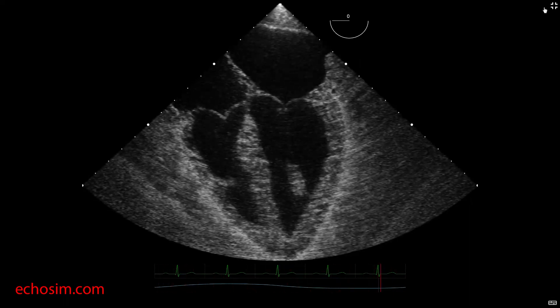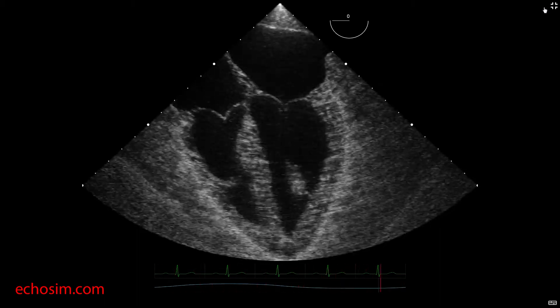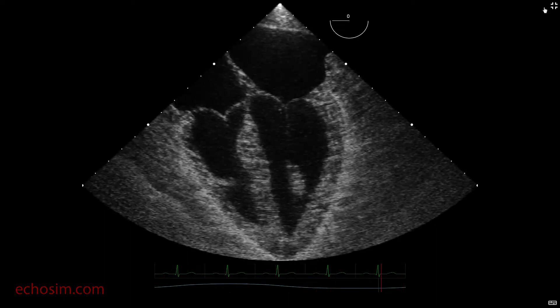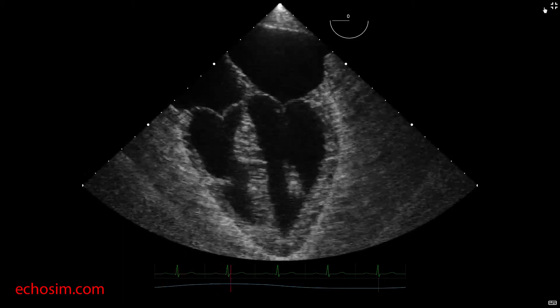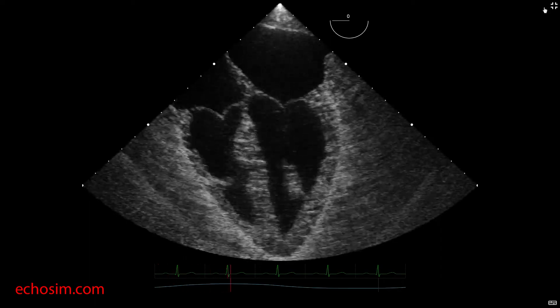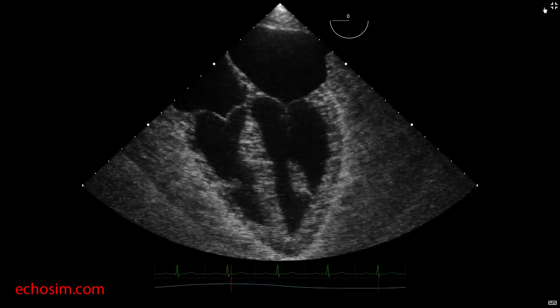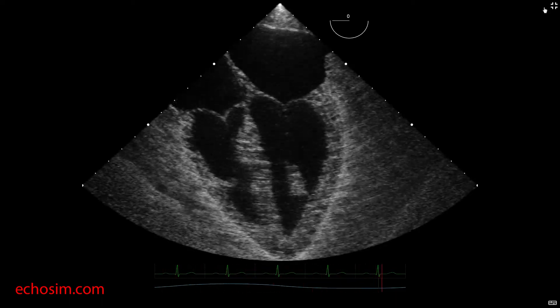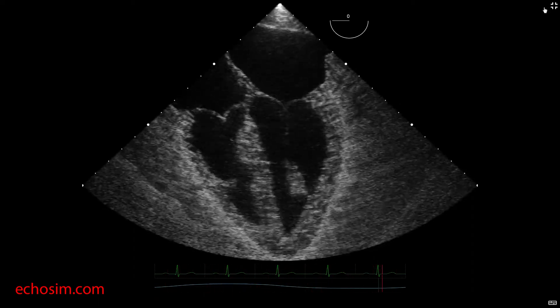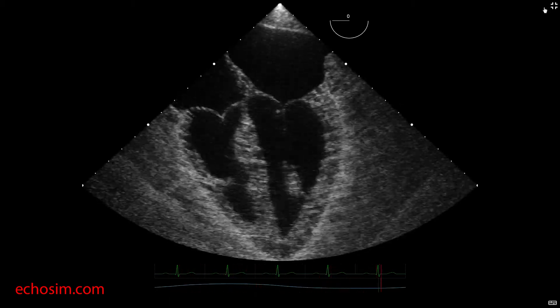The optimized left atrium will be demonstrated by maximized left atrial area. The optimized left ventricle will have maximal length and an immobile apex. Note that not infrequently, retroflexion maneuvers can cause the probe tip to lose contact with the anterior wall of the esophagus, causing loss of acoustic transmission and image degradation or complete loss. If this occurs, a foreshortened view of the left ventricle must be accepted.